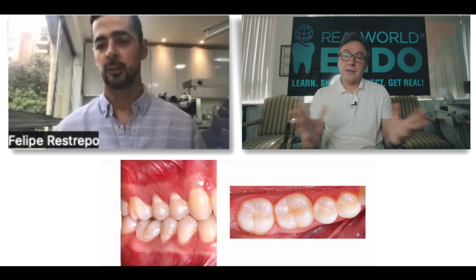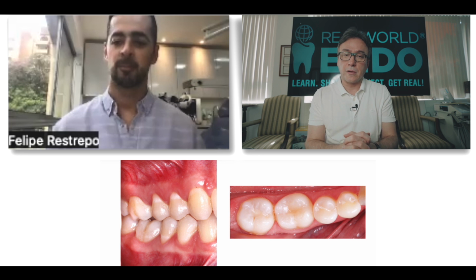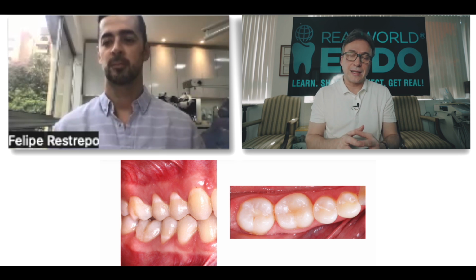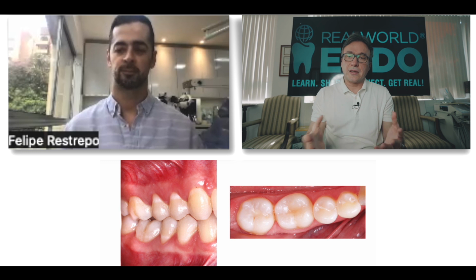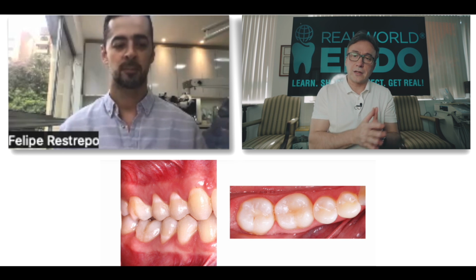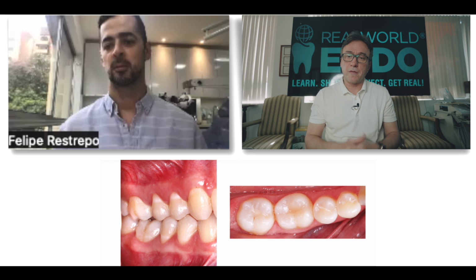Yeah, so I think this is really a great summing of the two different case scenarios, one involving a fresh extraction socket, the other one a tooth where there's an eventual space that needs to be filled. And, in both cases, I think that this was really a wonderful service to the patient, of minimally invasive manner of replacing a tooth with a wisdom tooth that wasn't needed, treatment planning it perfectly.